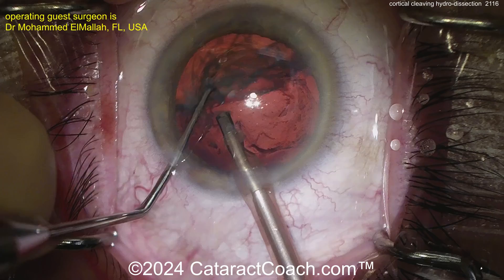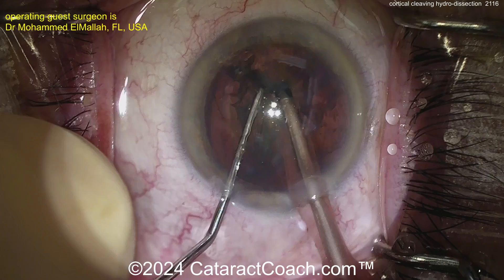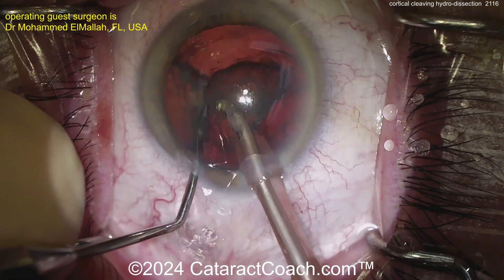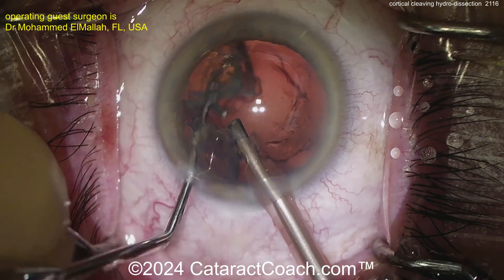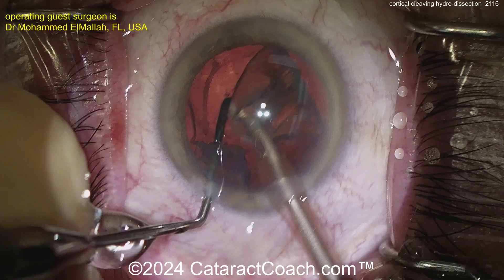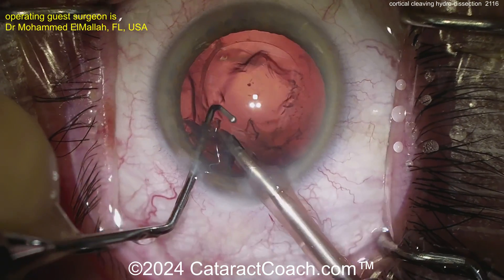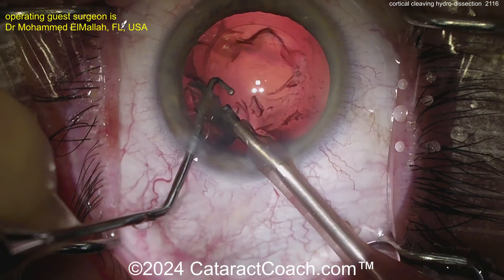You've seen other surgeons with neat techniques — the Rossatelli spin technique, where Dr. Rossatelli spins the nucleus many times to separate all the cortex, then removes the entire material with just the phaco probe and no IA probe. Our guest surgeon here does a beautiful job taking out the last bits of nucleus, and look in the capsular bag — beautifully done, there really is a minimal degree of cortex, if any.